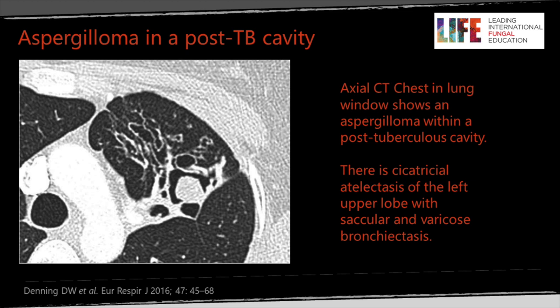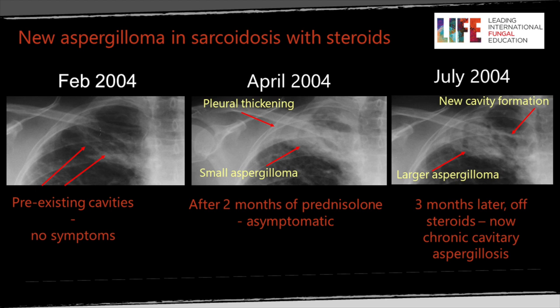Here's another aspergilloma example where the fungal ball is quite smoothly demarcated, and the meniscus wouldn't be as easy to pick up because there's quite a lot of adjacent cicatricial deformation with bronchiectasis — CT is the best way of showing this. On plain radiography, in February 2004 there was just patchy shadowing with a slight cavitary formation at the right apex. By April of the same year there's increased pleural thickening just adjacent to the clavicle, and you can see the early part of the crescent. Within three months that crescent is very obvious, with the fungal ball sitting within the cavity. There's also evidence of new cavity formation medially — progressive cavitary aspergillosis.